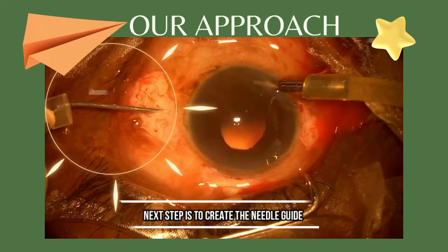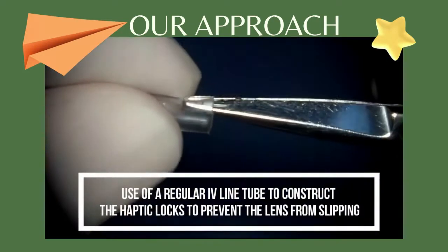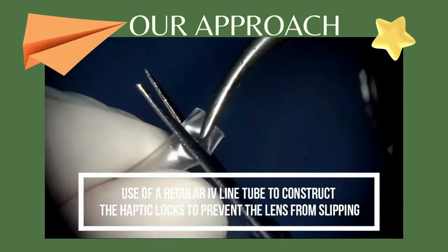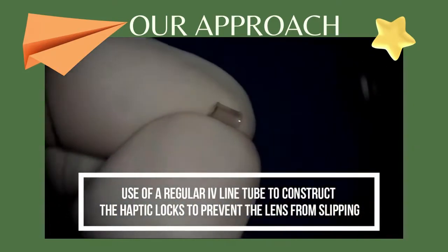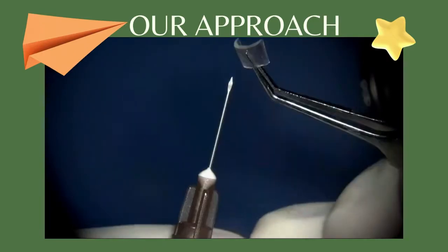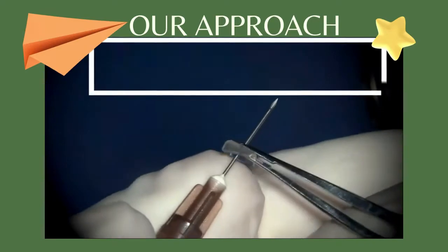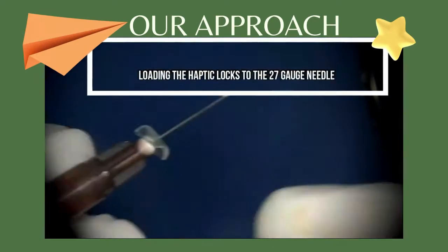Now this is the second custom instrument that we have created to guide the haptic and externalize it. The first thing that you will need is an IV line tube, where you cut a 3mm segment out of it and convert it into small square shaped pieces. You then take a 27 gauge needle, which usually comes with a 1 ml syringe, and load the piece created from the IV line into the 27 gauge needle.